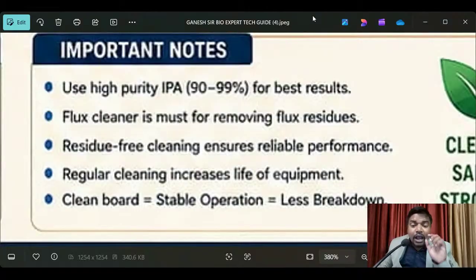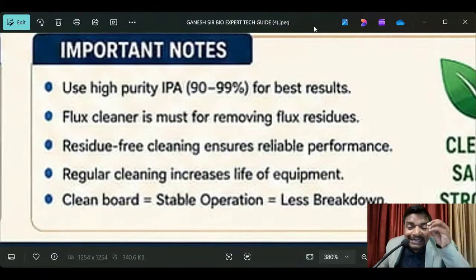See how much you performed, that is not the matter. How the equipment is working is what is important, and reliability is very, very important, understand? So for you to get reliability and good service, these are the points you have to take into your work area, then only will you become a technical master in biomedical engineering.